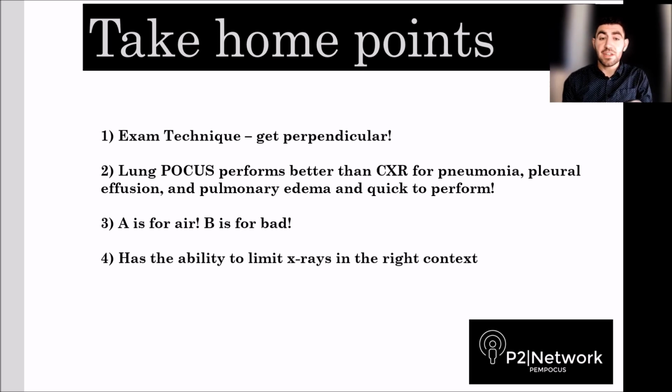let's see if we can start limiting chest x-rays that are unnecessary, especially when we can get the information without radiation.